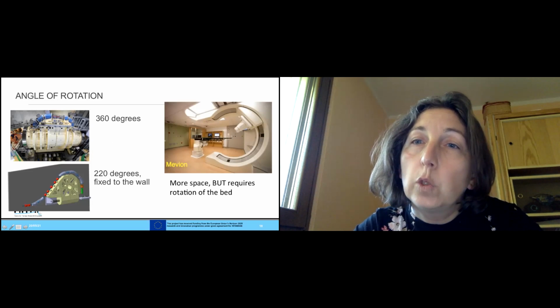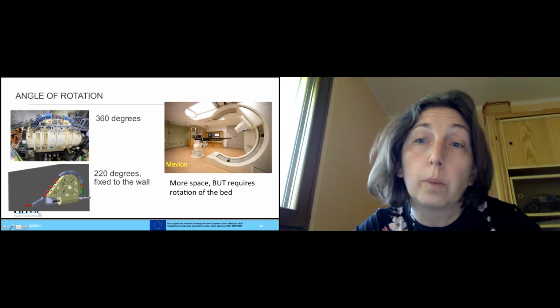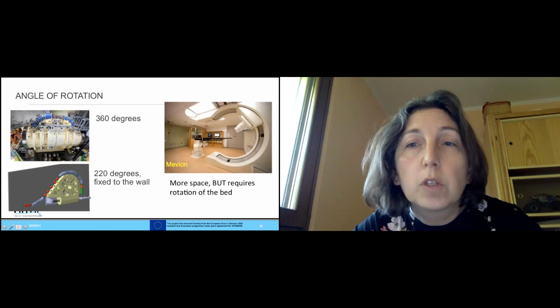And here you only have the treatment room. And you see that since it is not 360 degrees, the treatment room is much larger. Here you can fit the bed and nurses, and it's not claustrophobic. So you have more space.